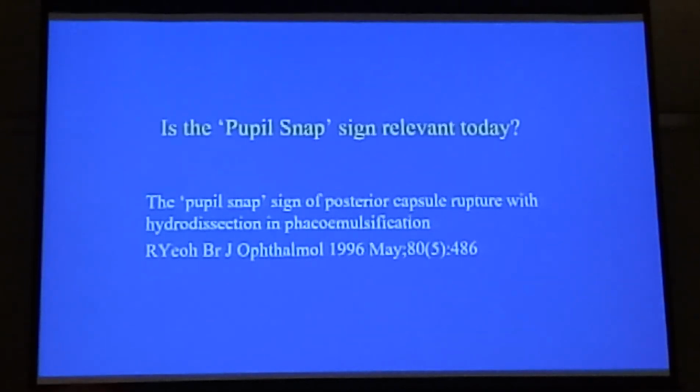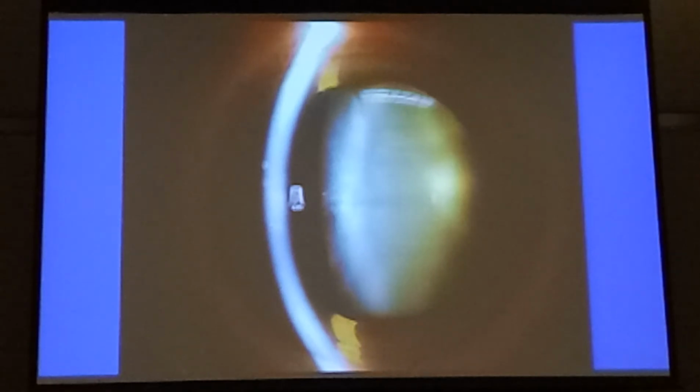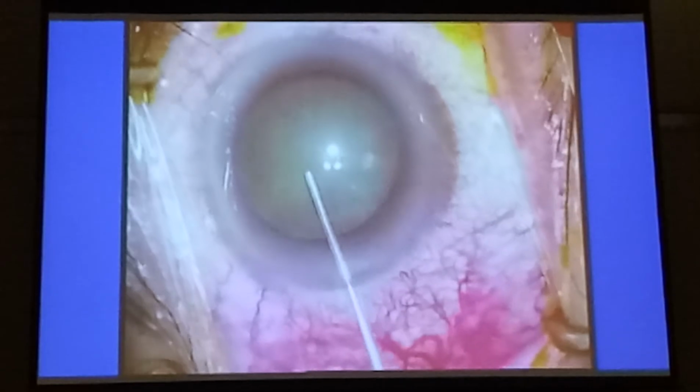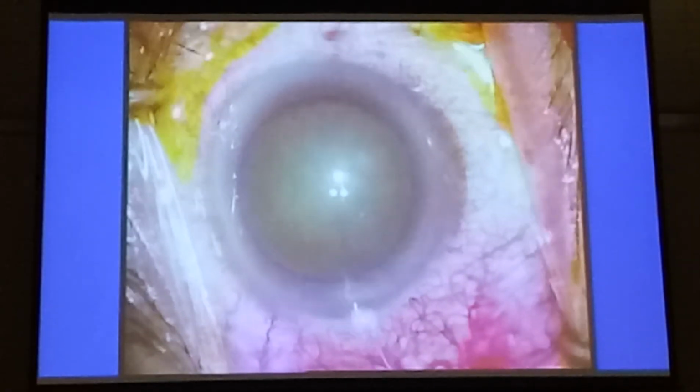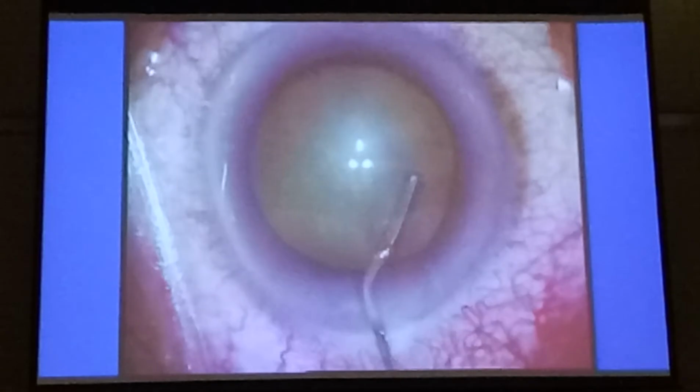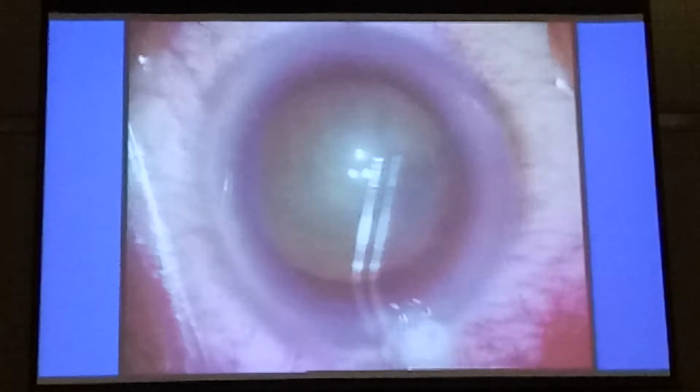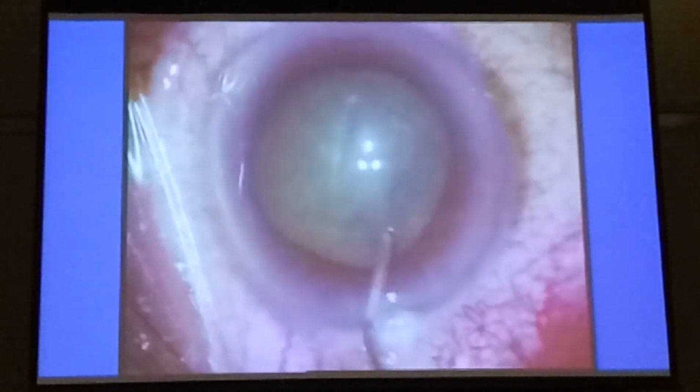But is the pupil snap sign still relevant today? Well, I tell you, it still is. Here's a patient. This is one eye. This is the other eye. About 2 weeks before she saw me, she had an injection of intravitreal anti-VEGF agents, and developed this cataract very, very rapidly. And basically, this was the eye. You can see it's a bit of a swollen intumescent lens. And this patient basically had a lens touch cataract. The intravitreal injection had ripped the posterior capsule. There was a slight snap there. You see that? During hydrodissection, there was a gentle snap.